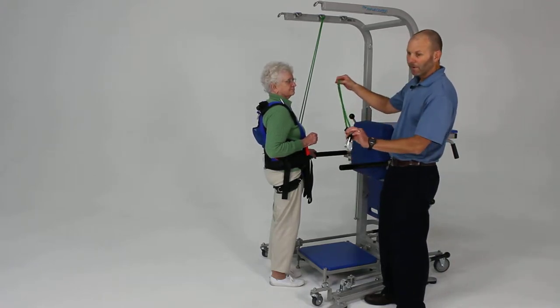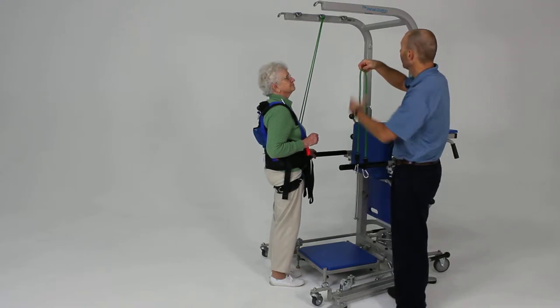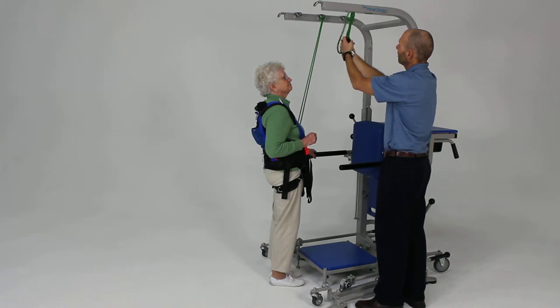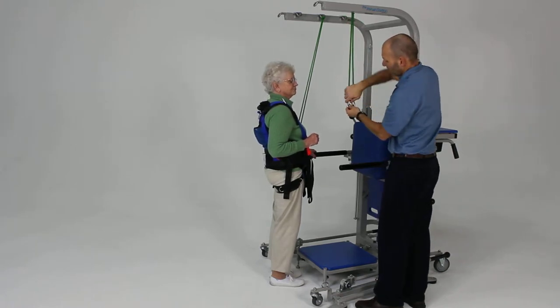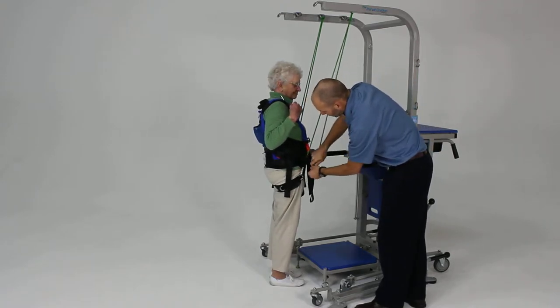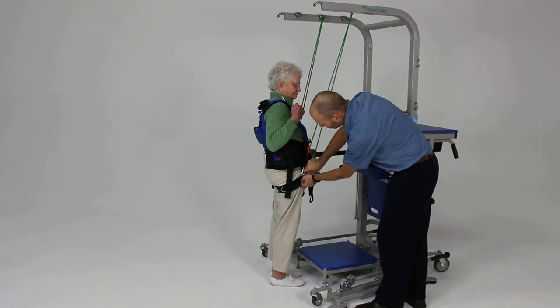We're going to take some of our elastic cords and anchor them to the top of the unit using what's called a girth hitch — we just take it through, fold it in half, and drop it back down through that loop. Then we're going to anchor these to the D-rings on the pelvic support strap that goes underneath the gluteal fold.